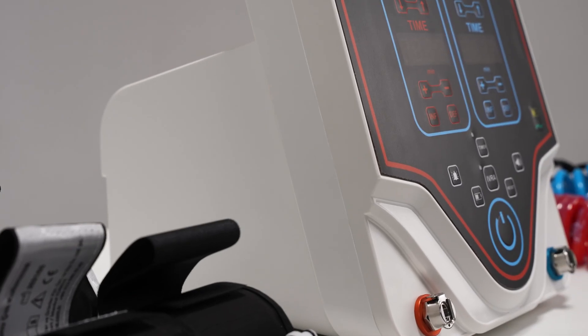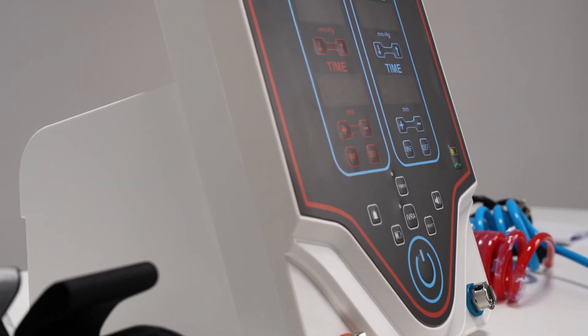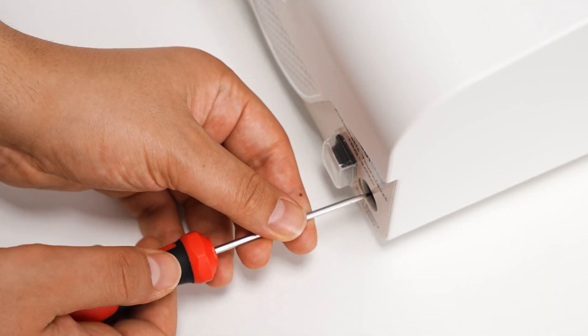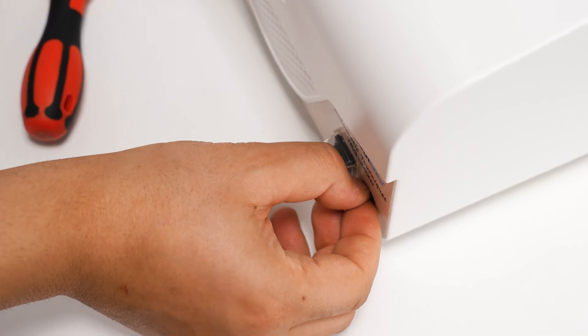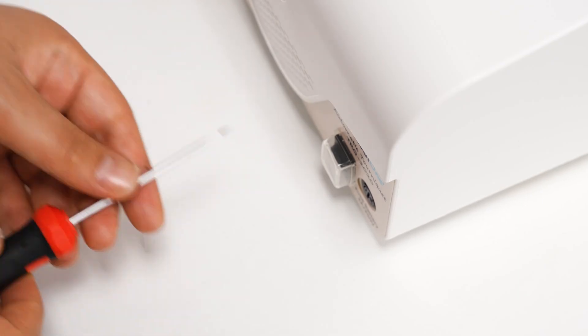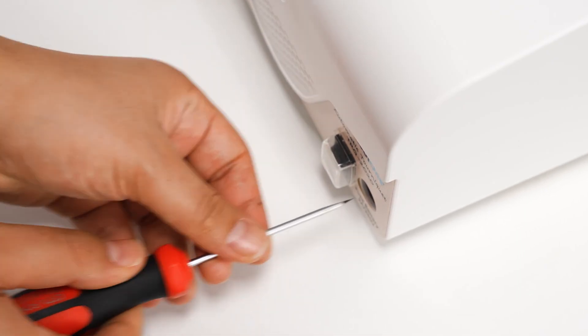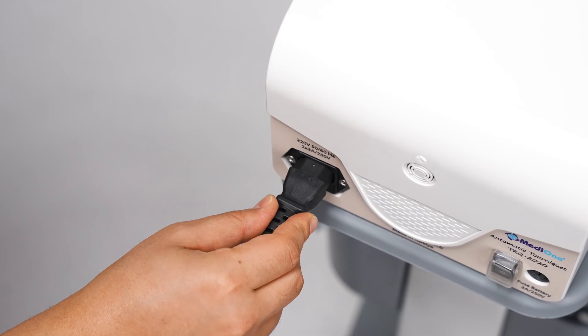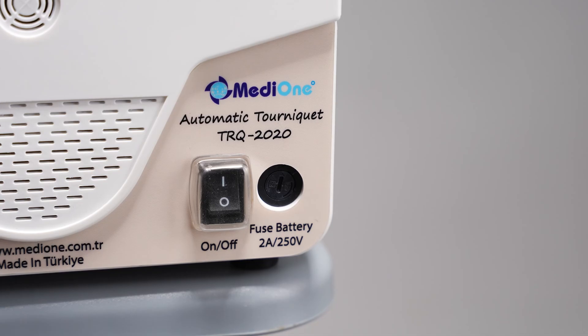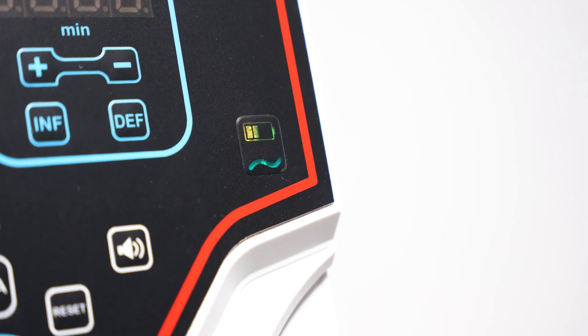All the materials are now out of the boxes. Now we can move on to the preliminary stage. First of all, insert the battery fuse into its slot. Connect the power cable to the device and the power supply, and turn the on-off switch on the back of the device to the on position. If we see that the AC power indicator in the lower right is green, it means that the connection has been successful.